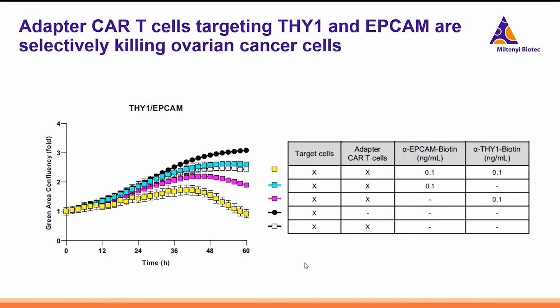So now, after identifying marker pairs as potential CAR T cell therapy candidates for the different cancers, they tested one of the identified pairs. They just tested one of the identified pairs, which they identified for ovarian cancer, not for glioblastoma and pancreatic adenocarcinoma. They went for the ovarian cancer.